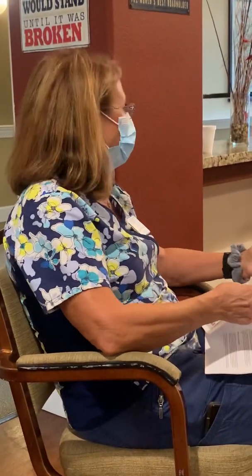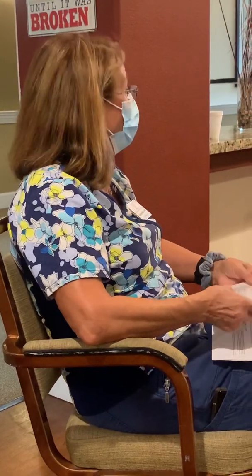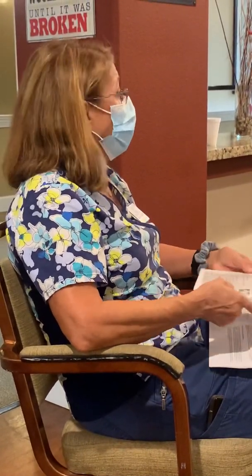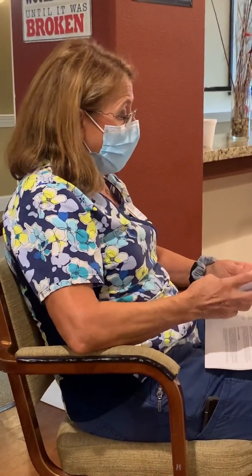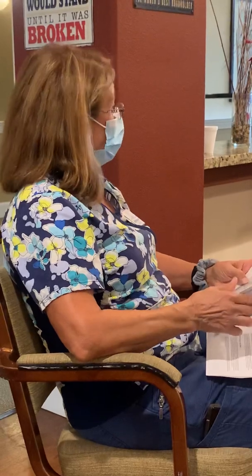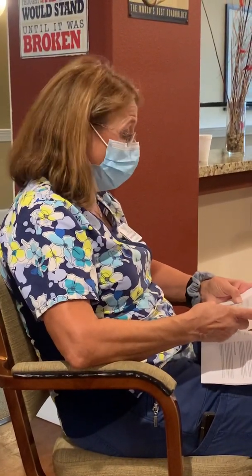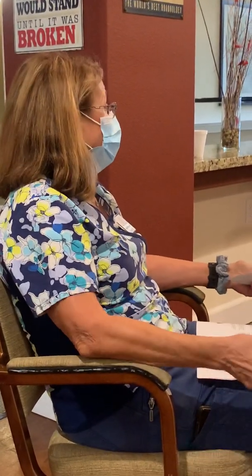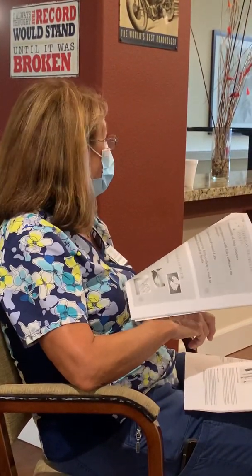So how can we prevent the urinary tract infections? Of course, we're going to always assess every time you're in there, if you're doing any kind of care, bathing, anything, always assess that Foley catheter. Make sure that you do Foley care, especially after they've had a bowel movement. And there's also alternates. You know, not all patients need a Foley. Make sure that they're either in a clean bed. They can have condom catheters if they're a male.